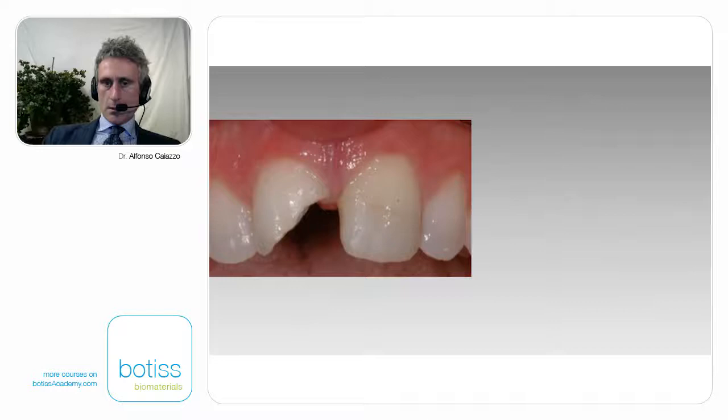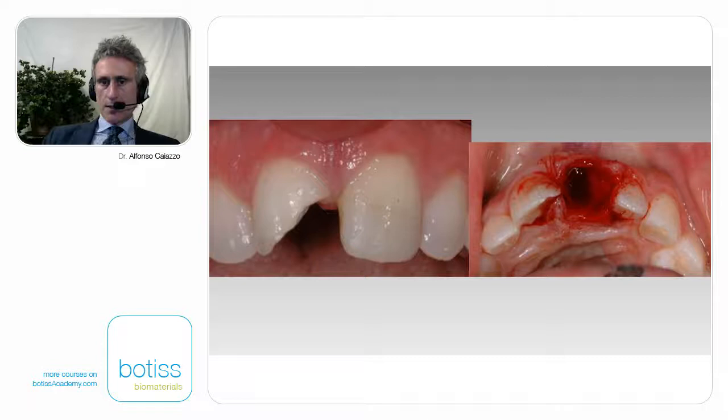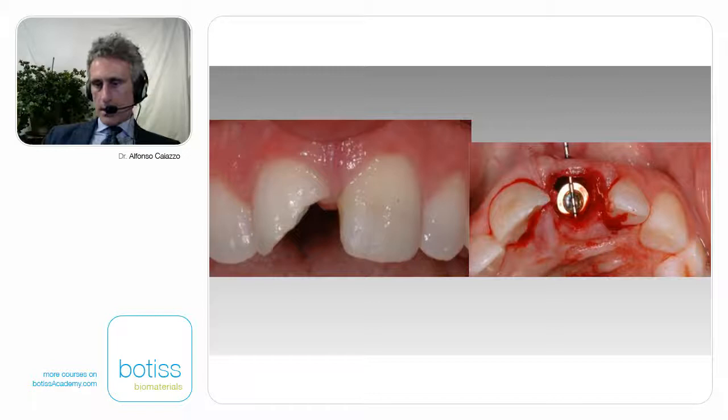And we used to do this all the time, taking out an anterior tooth, placing the implant, mapping the site. Don't place any graft at that time. This is an old case. This is the way I used to do it, placing the implant, not doing any buccal plate preservation, socket preservation, nothing. I wasn't using any grafting material at that time.